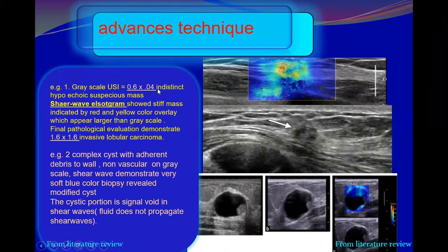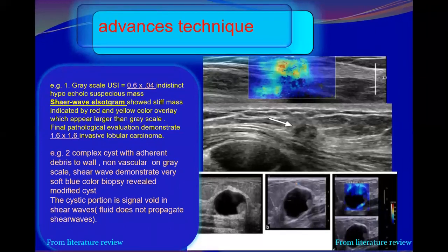Okay, look for the lesions in the gray scale and in the biopsy result, following with the elastography. And as we mentioned, your case, the complex cyst, is definitely borderline. This is BI-RADS 4A. So here the shear wave elastography helps us in downgrading the lesions.